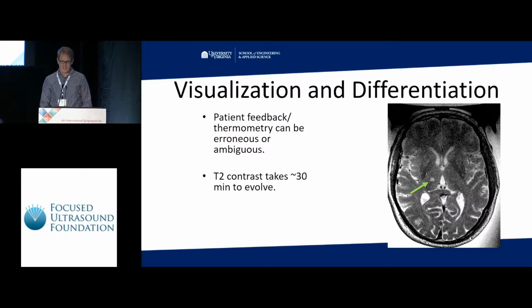There are some problems with using this approach. First, it can take up to 30 minutes or longer for the edema to fully develop so you can visualize this lesion. And second, T2 weighted images help you visualize edema, which is not exactly equal to ablation.